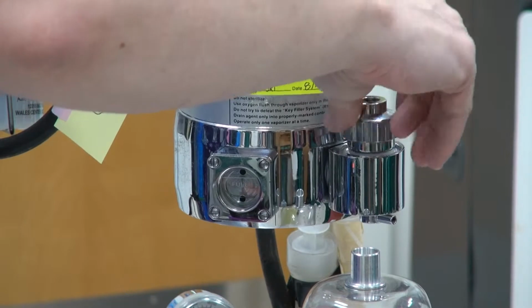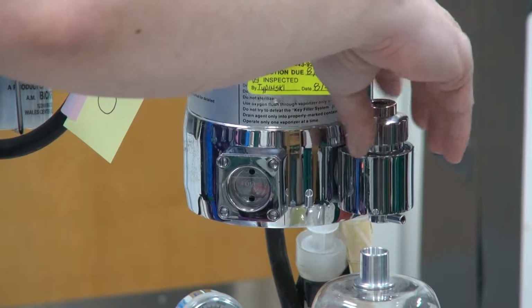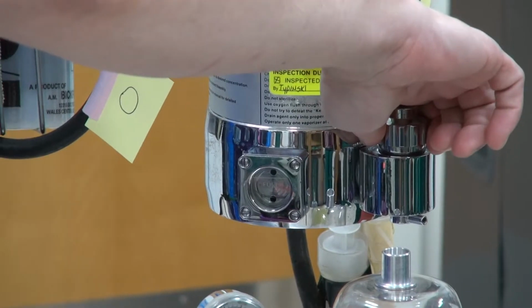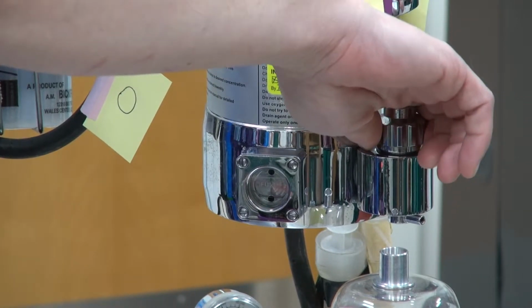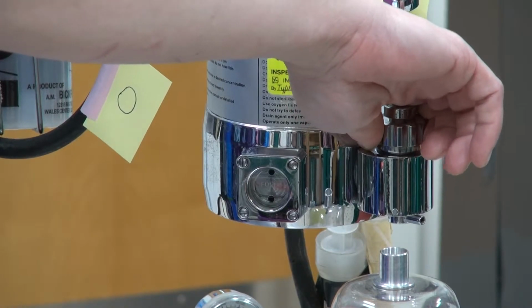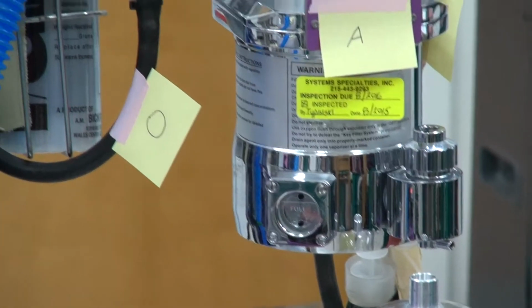Can I over tighten this? No. You can't over tighten this enough, okay? We don't want any leaking into the environment. Why? It's pollution, right? Okay, what's our B?